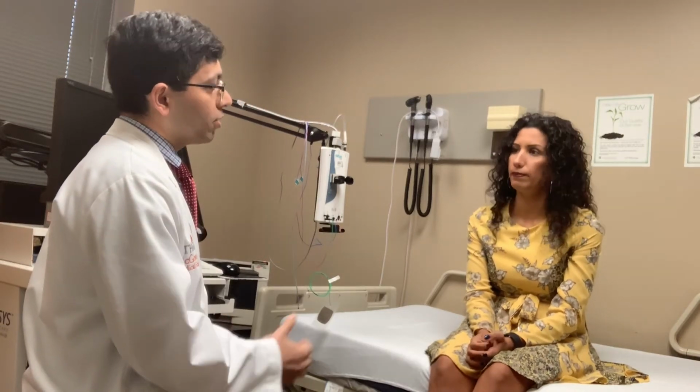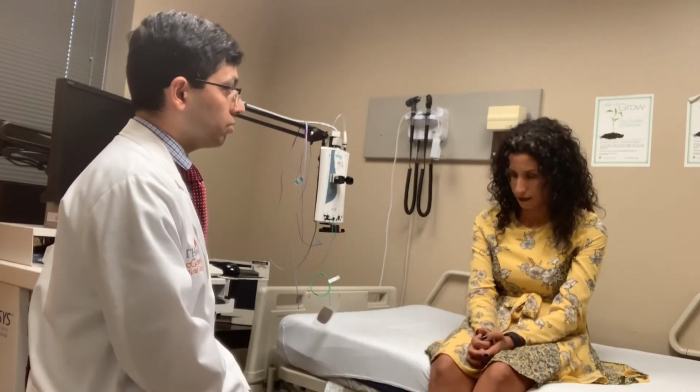No, I think you explained everything pretty much. Thank you. One question before we start the test: are you on any blood thinners? No, I'm not. Okay. We wanted to ask to make sure that we don't do any harm to you.